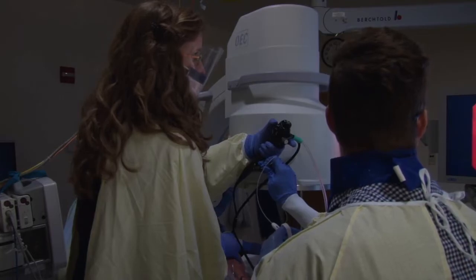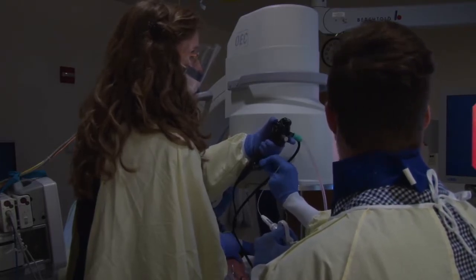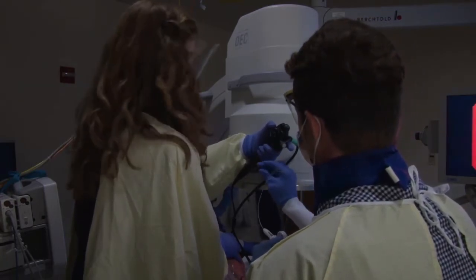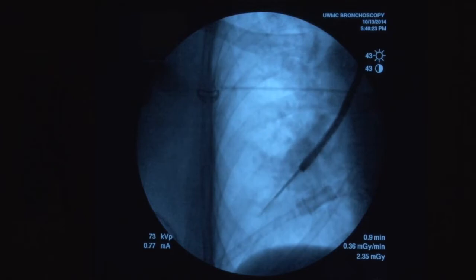This approach can be very useful for learner bronchoscopists so that their supervisor can monitor them closely and provide feedback. An alternative approach that uses less radiation is to take a spot fluoro image right before taking the biopsy sample just to make sure that the forceps appear to be in the correct location.